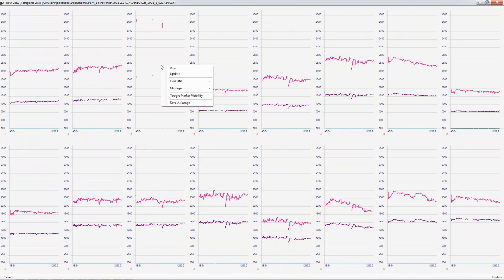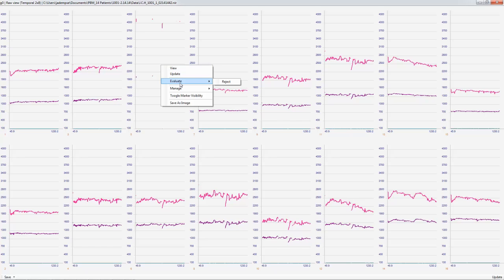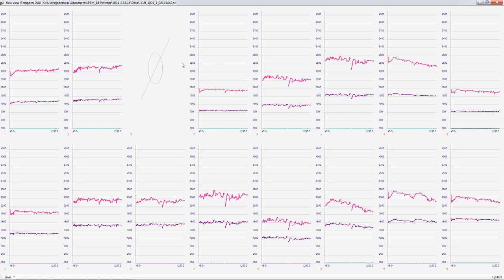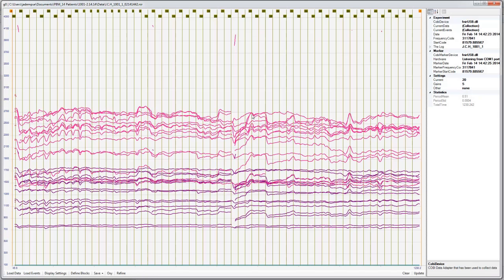So then we're actually going to right click on this, evaluate, and reject this optode. So now we've rejected this optode. We can close this window, and we're just going to exclude that optode from our further analysis.